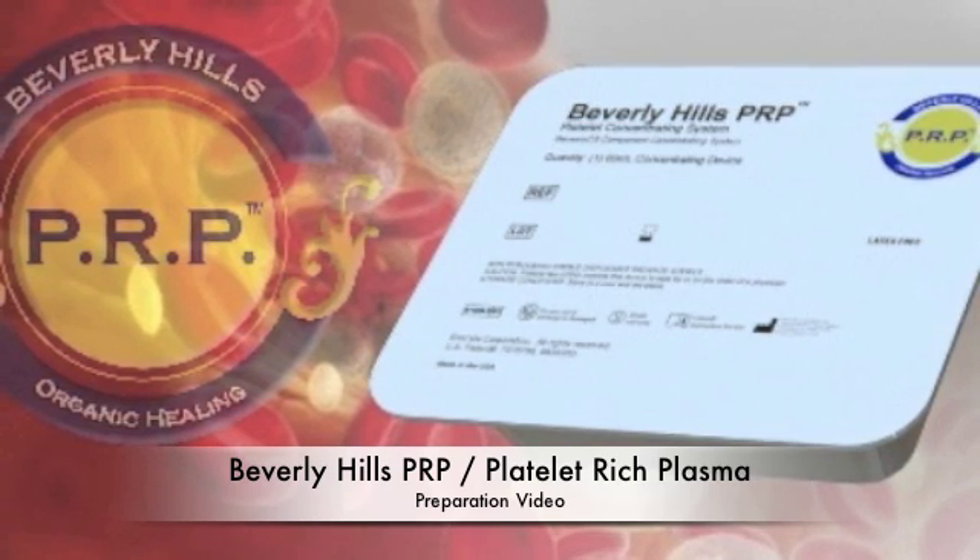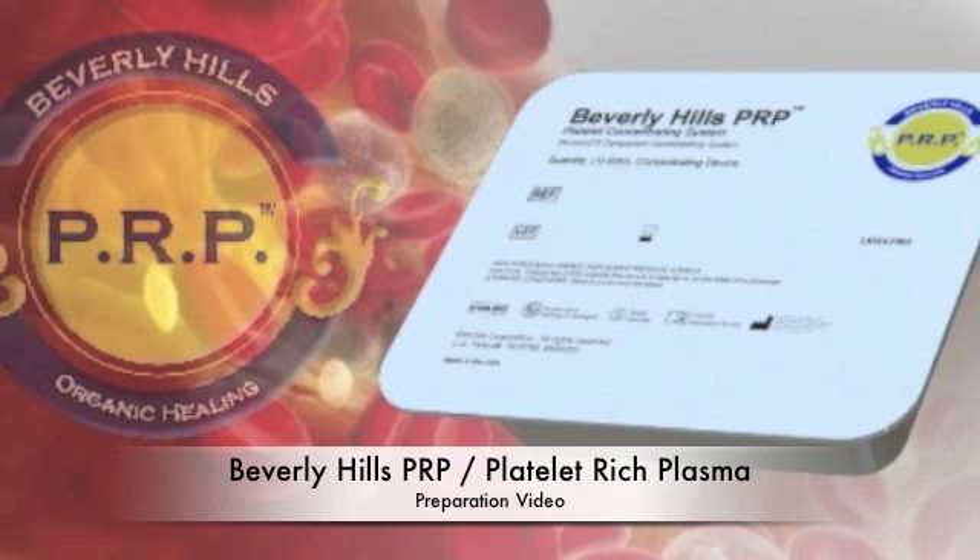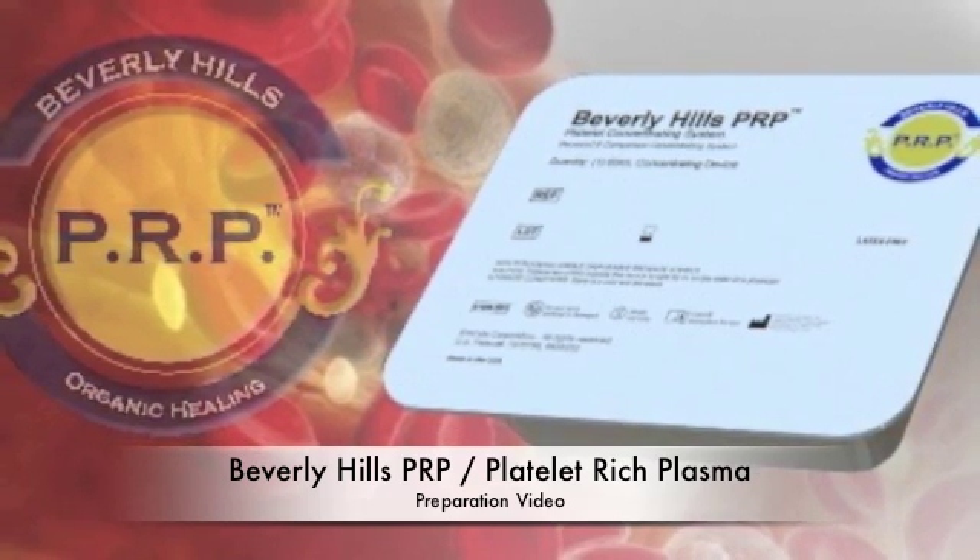Welcome to the platelet-rich plasma preparation video, where you learn how to process blood with the concentrating devices.